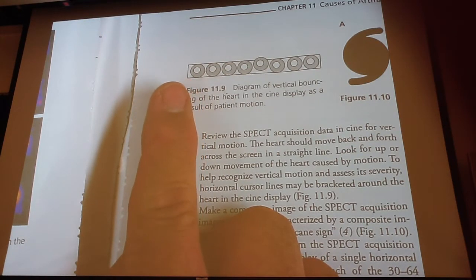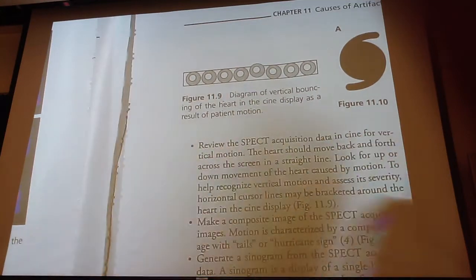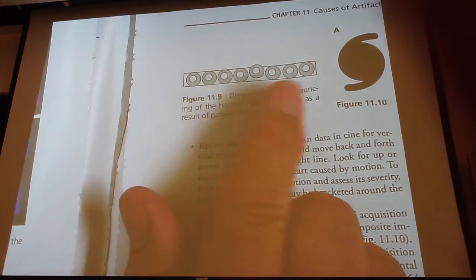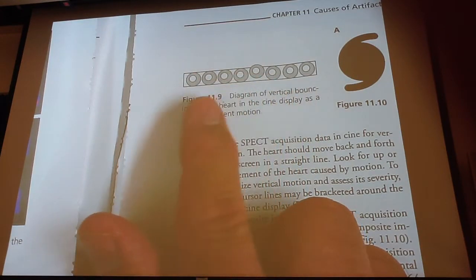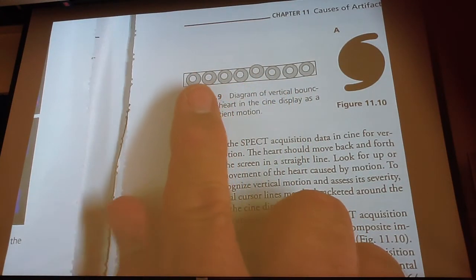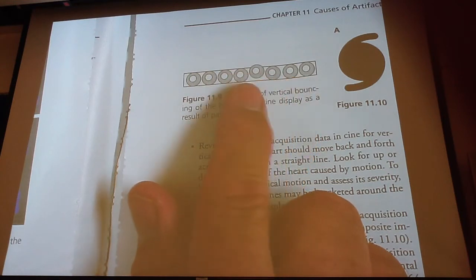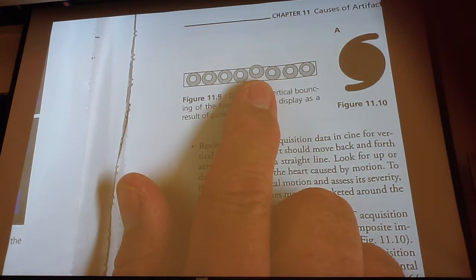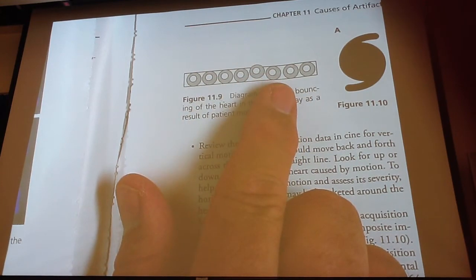Normally it starts with the apex and works its way through the heart to the base. Each one of these images is a different reconstruction of a different area of the heart. It should be a straight line. So this frame here is where the patient moved. Maybe their arm got tired of being in a certain position, but something happened and they moved. Does that make sense?